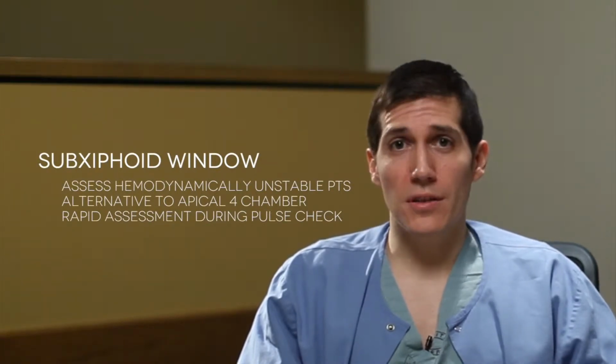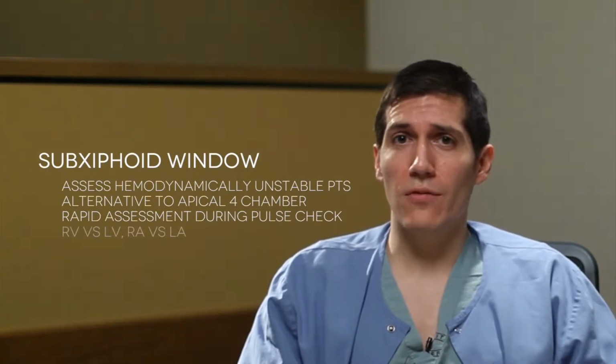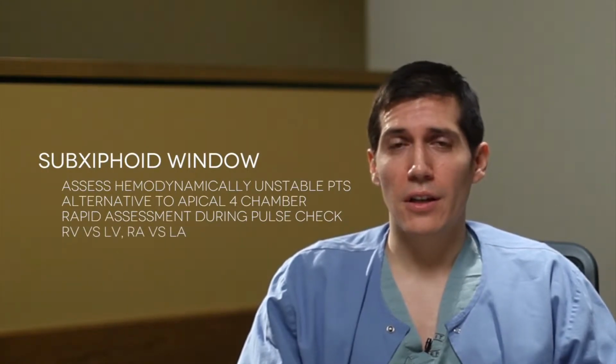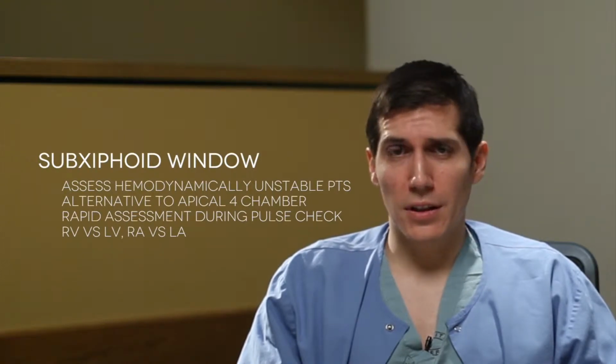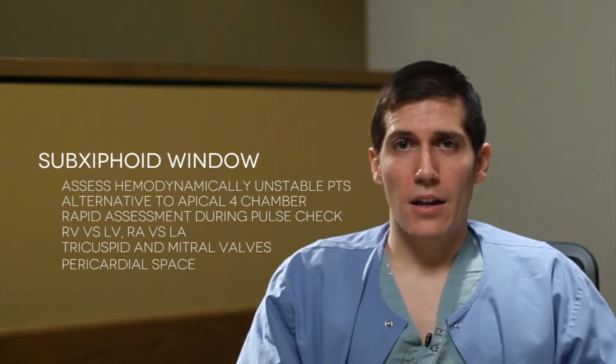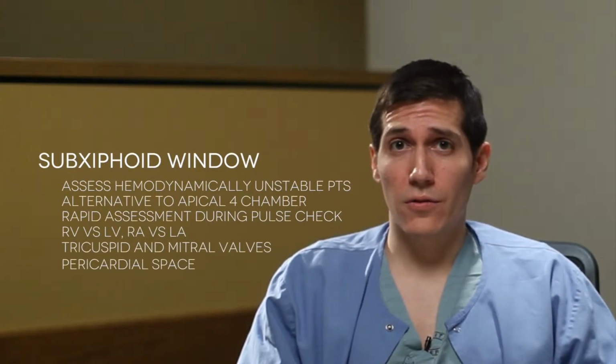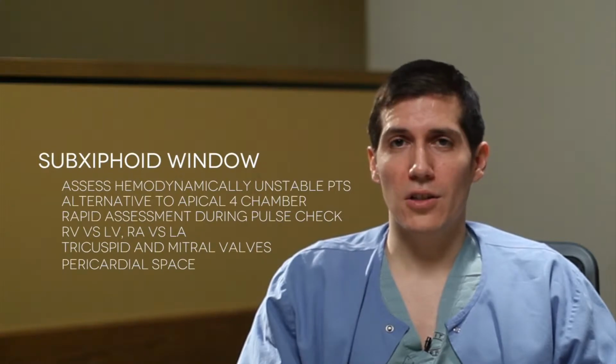This is because you can see certain things. Just like in an apical four-chamber, you can see the right ventricle versus the left ventricle, the right atrium versus the left atrium, the tricuspid valve, the mitral valve, and the pericardial space so that you can possibly diagnose pericardial fluid leading to tamponade physiology.